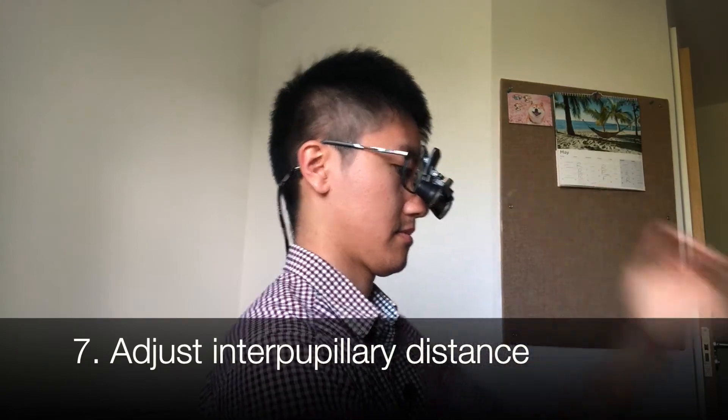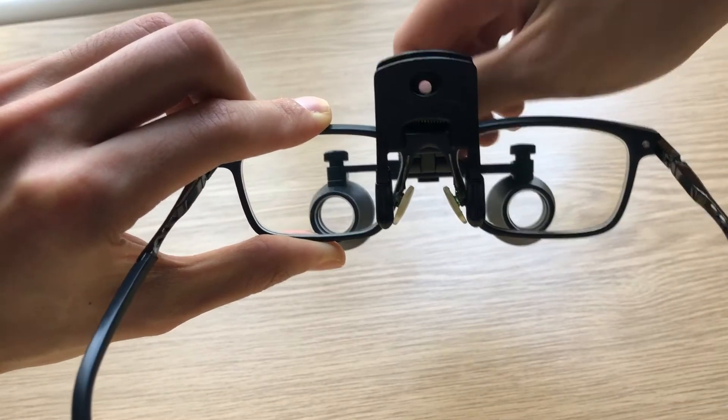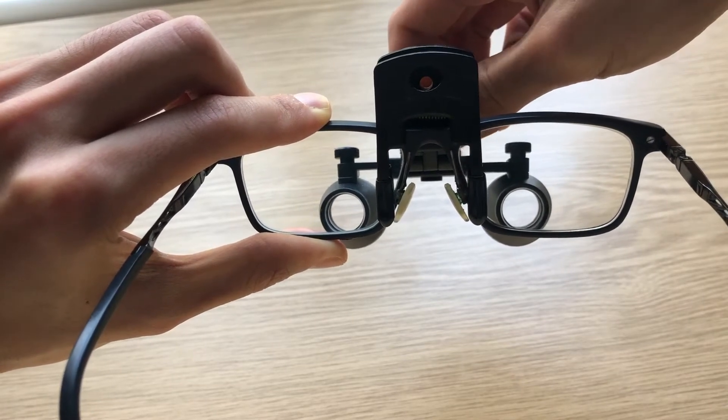Finally, I adjust the interpupillary distance. To do this, you focus on an object at your working distance, such as your thumbs. You move the lenses wide apart with the dial until you see two images, then turn the dial and bring the lenses together so that the two circles become one and you're seeing in binocular vision. This is very similar to adjusting a microscope, so if you've used one before, this will be quite intuitive.